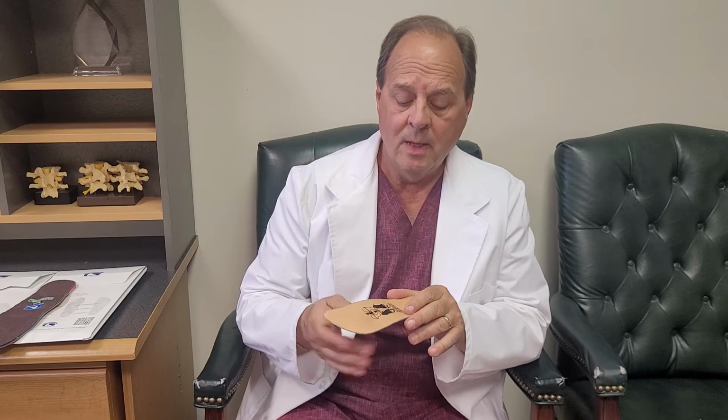Now, these days a lot of people are working from home. If that's the case, and you don't wear shoes at home, you might want to go out to Walmart or somewhere like that, buy a cheap $15 pair of sneakers, and put the orthotic in them and keep them in the house. So you have a house shoe to wear it in, because you probably need to wear the orthotic 4 to 6 hours a day in order for it to be effective. If you're not wearing it, you're not going to have any effect.